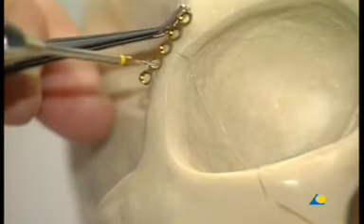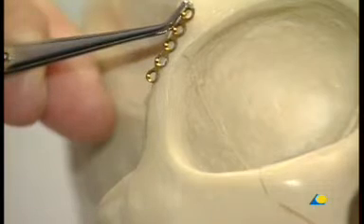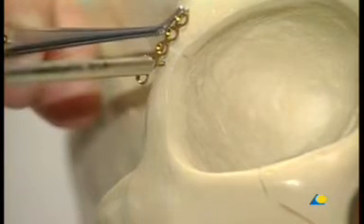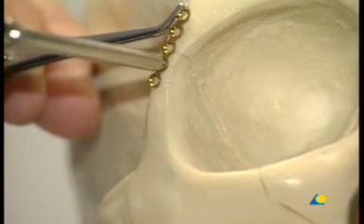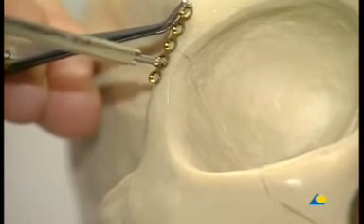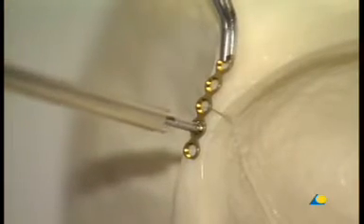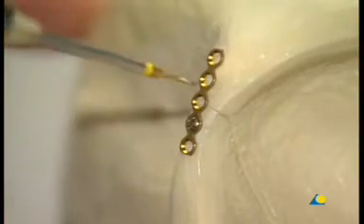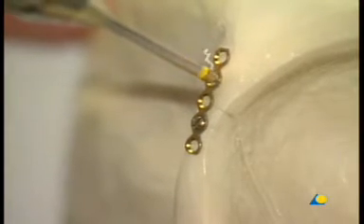The first hole is drilled next to the fracture line in the zygoma using a 1 mm drill. A 6 mm long 1.3 mm screw is inserted. The second hole is drilled in the first plate hole cranial to the fracture line.